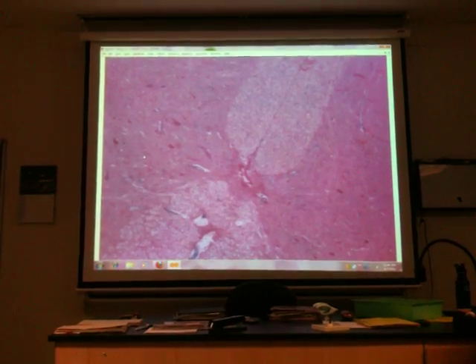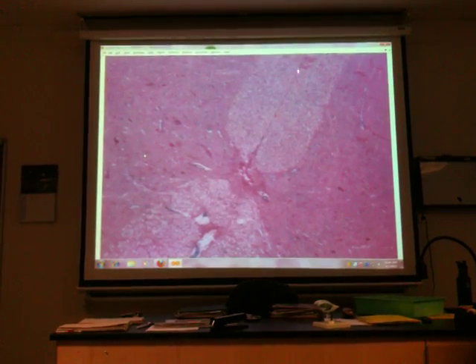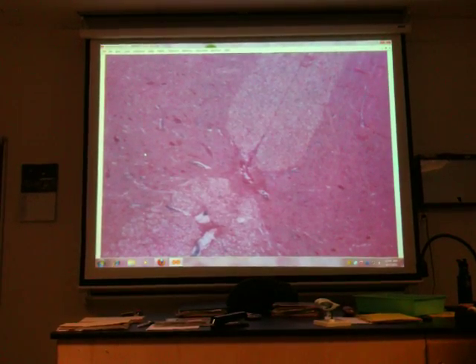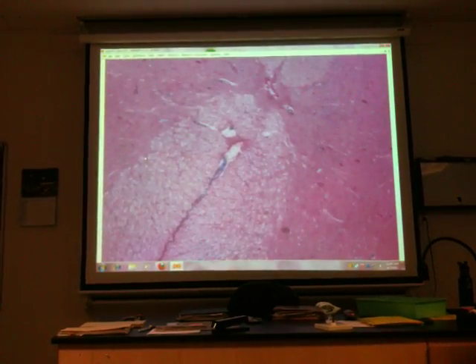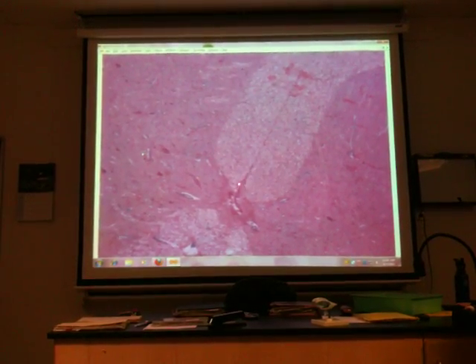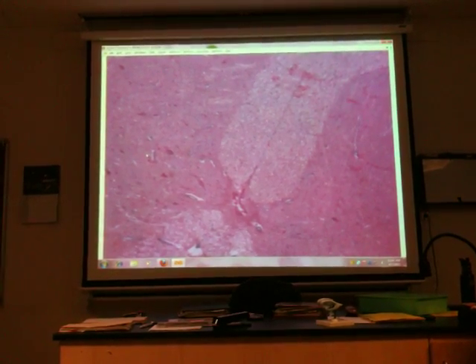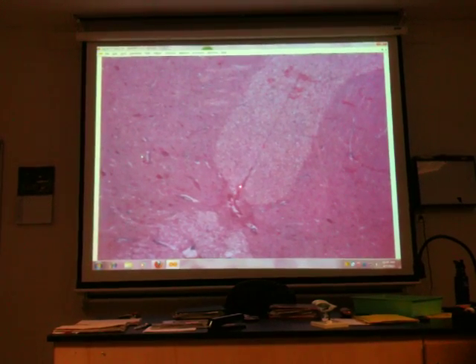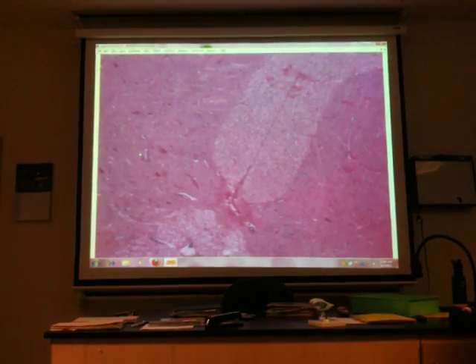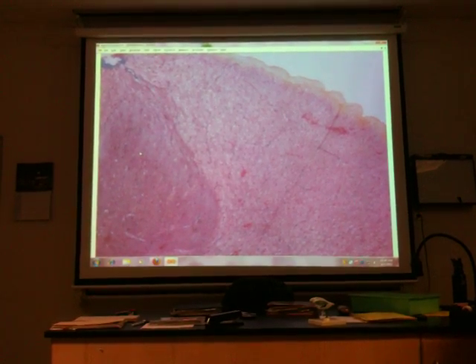Let's see if we can tell anterior and posterior on our spinal cord right now. Let's look at this feature and compare it to this feature. Okay, so this table over here is going to name that one. Posterior median sulcus. Okay. Point to it again. Posterior median sulcus coming all the way out to the surface of the cord.